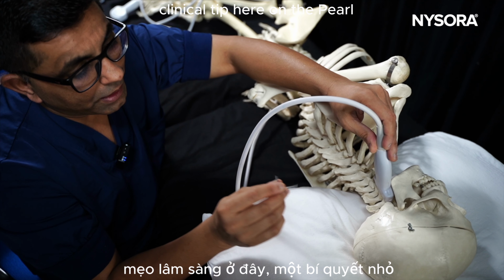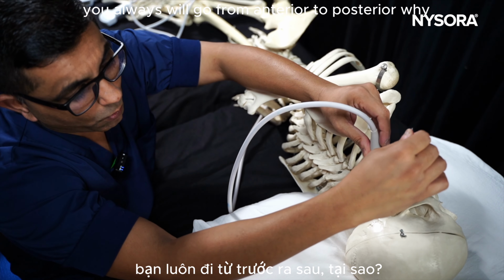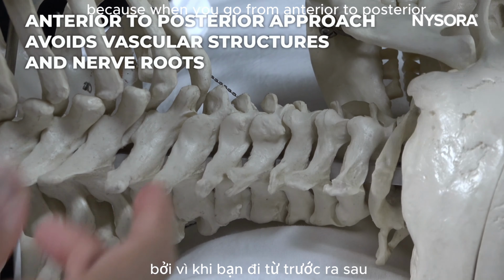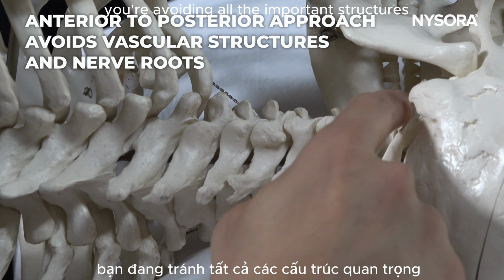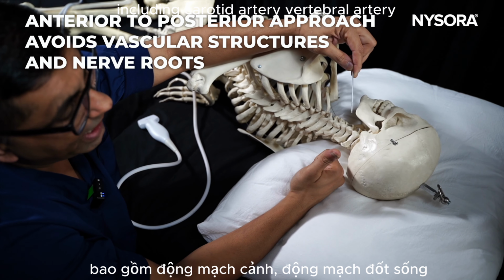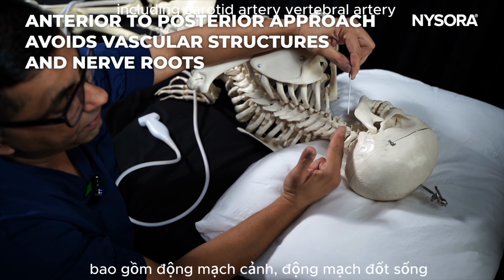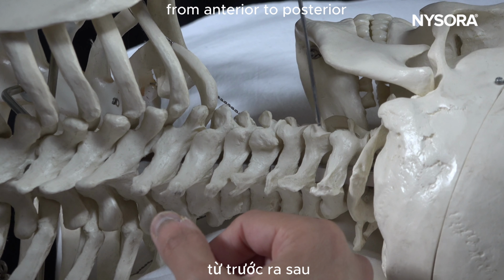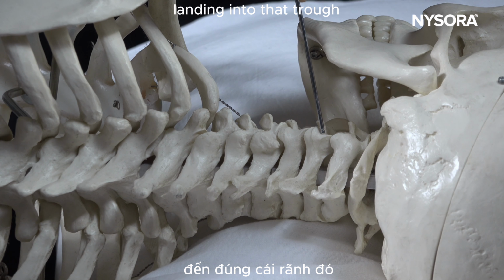Clinical tip here, or the pearl I would like to share, is that you always go from anterior to posterior. Why? Because when you go from anterior to posterior, you're avoiding all the important structures, including the carotid artery, vertebral artery, and nerve root. You will be bringing the needle from anterior to posterior, landing into that trough.